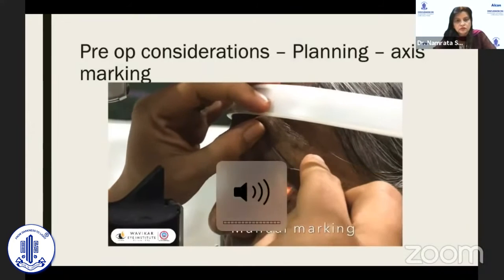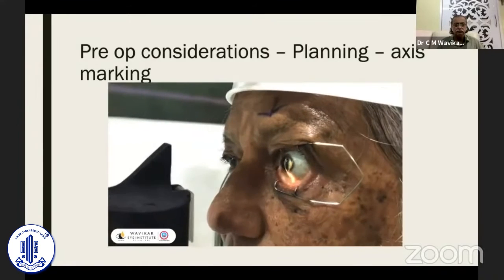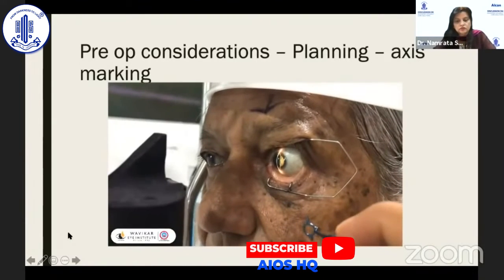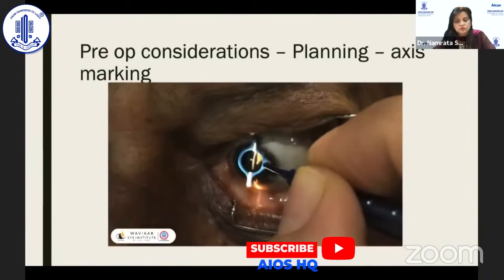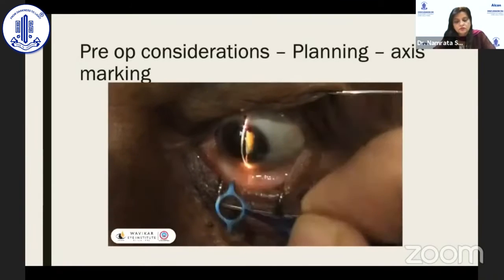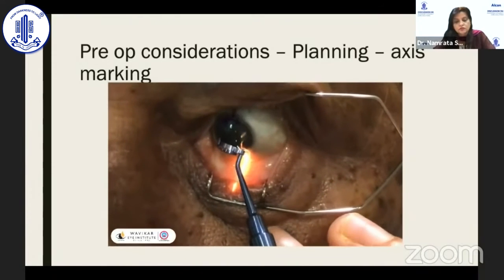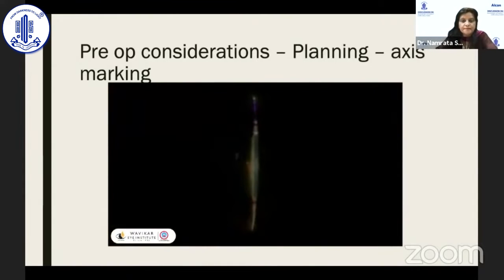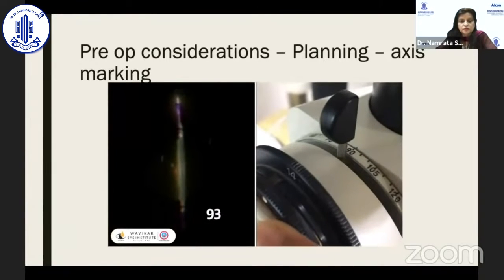For slit lamp marking: put an eye speculum after anesthetic eye drop. With a sterile bud, dry the inferior and superior limbus and conjunctiva. Ink the marking ends of the toric axis marker. Make a thin slit beam passing through the center of the cornea at the 90-degree axis and mark superiorly and inferiorly. For measuring the axis, pass a narrow slit through the apex and center of the mark where it crosses the limbus. Here the superior mark is at 90 and the inferior at 93 degrees.